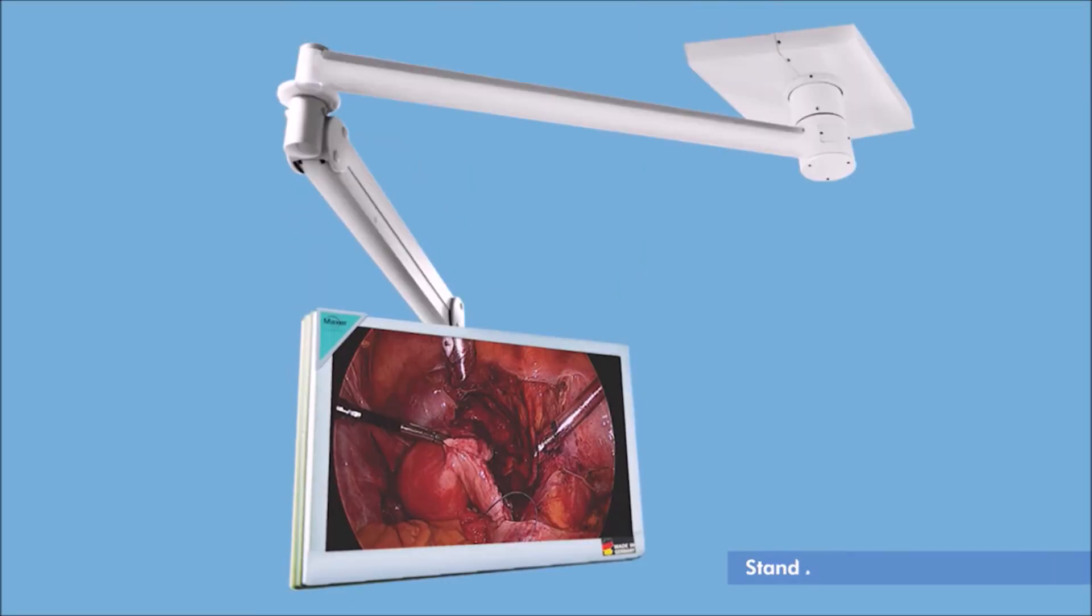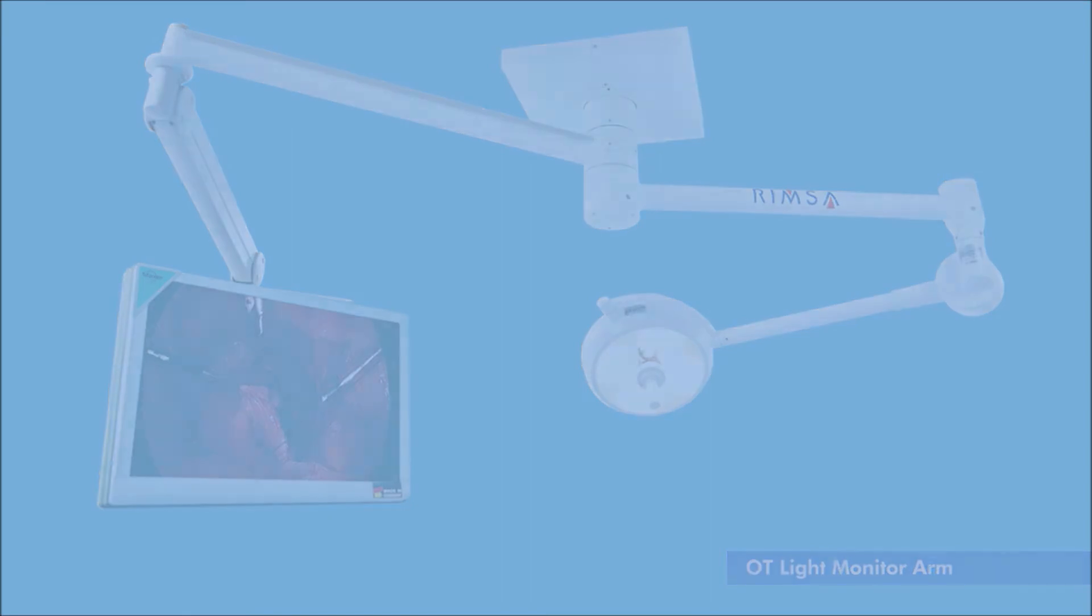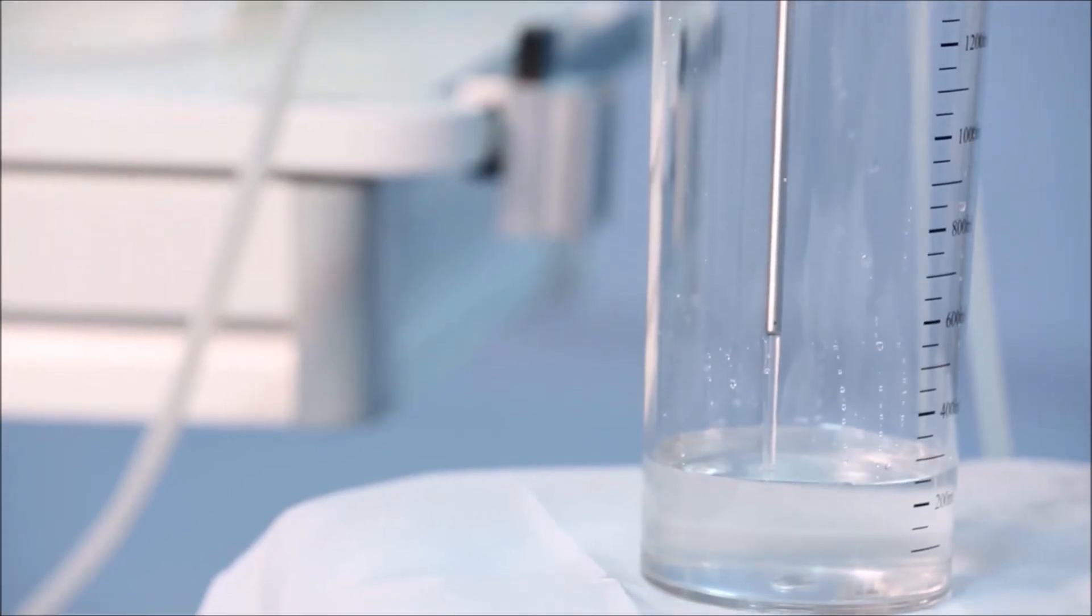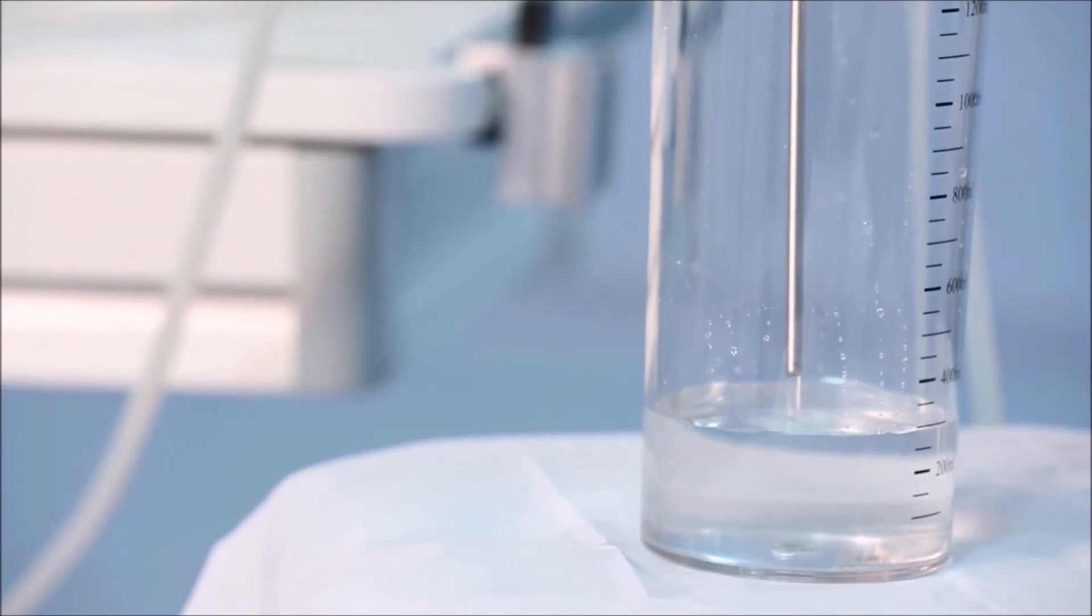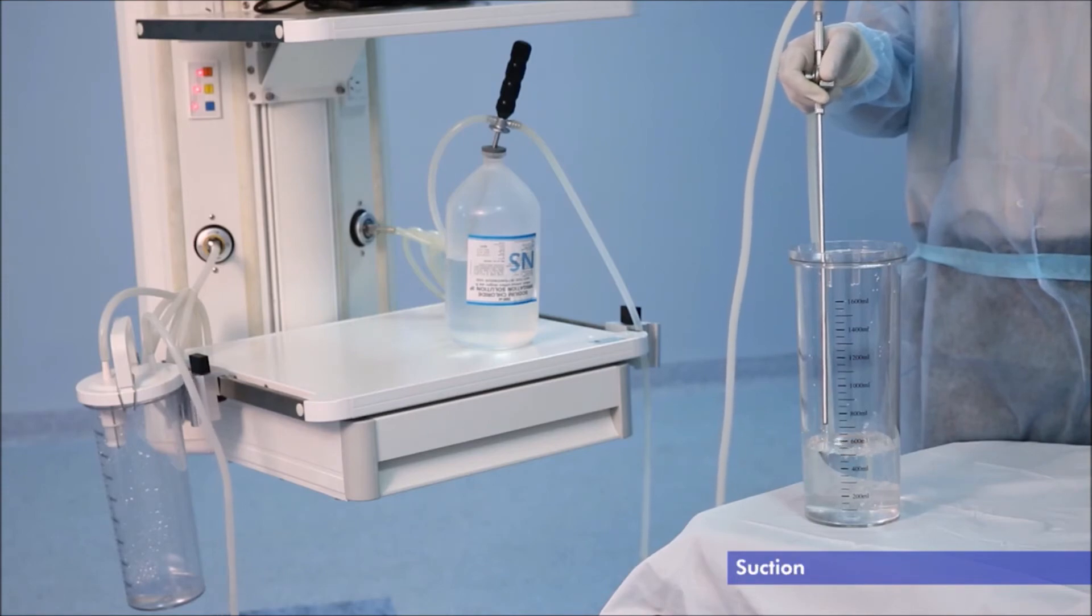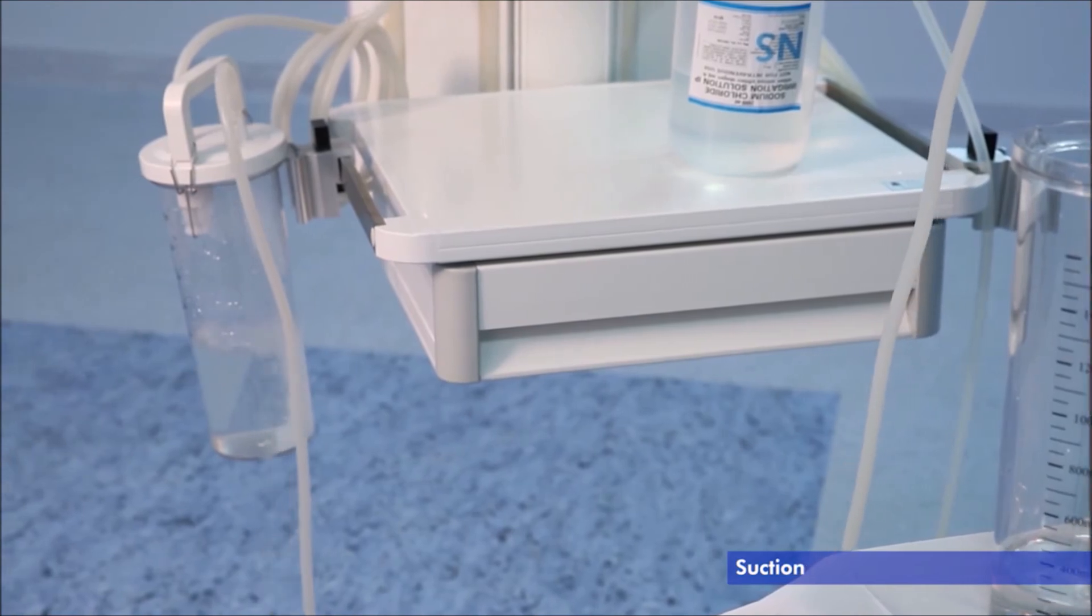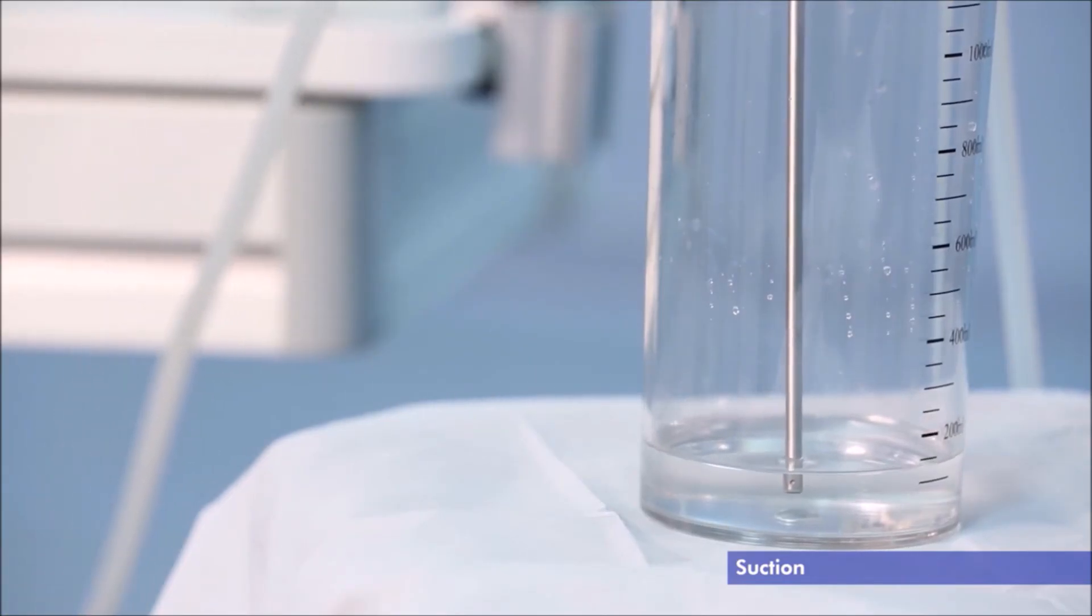Pridex can also supply standalone or OT light monitor arms for heavy duty monitors and dual screen monitors. Pridex pendant has separate connections for vacuum and air which can be used for suction and irrigation during laparoscopy or open procedures. This has enabled hospitals to avoid floor-mounted suction machines that make irritating noise.